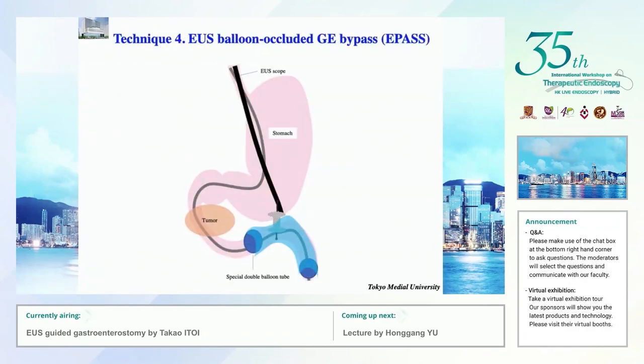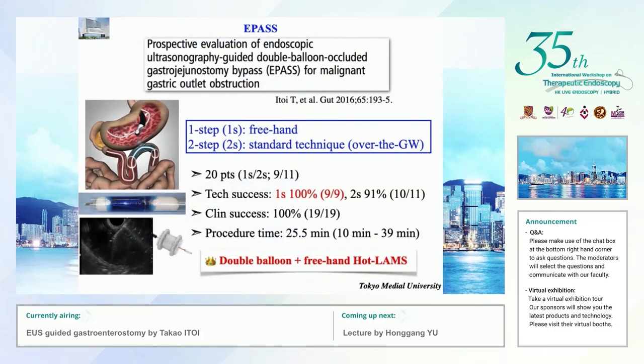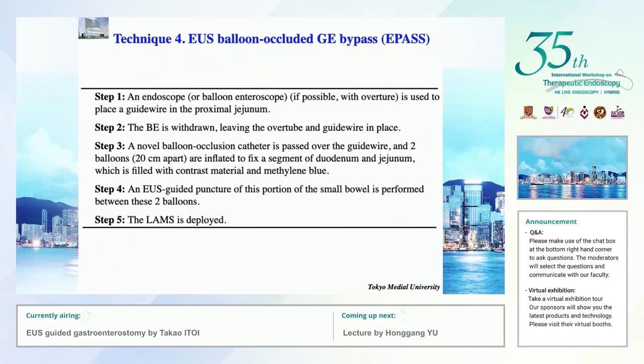Next, E-pass. E-pass includes two techniques, namely one-step and two-step. In other words, freehand and over-the-wire stent placement technique. Since one-step method is more effective without failed case, we frequently use the freehand technique now. I'd like to introduce the E-pass method.